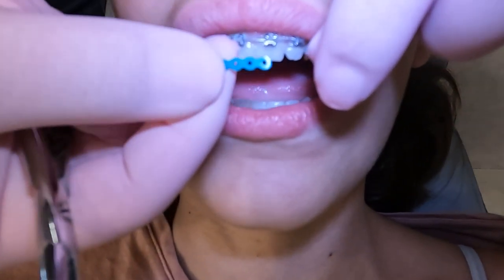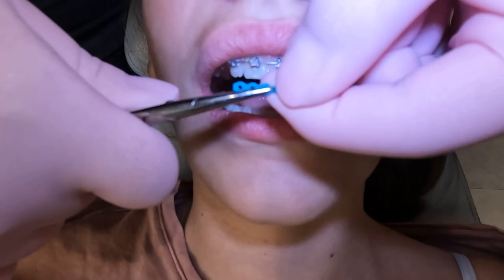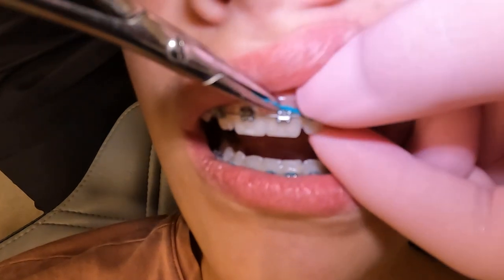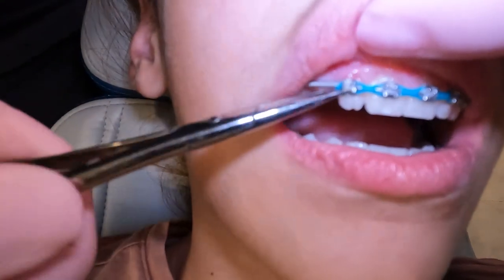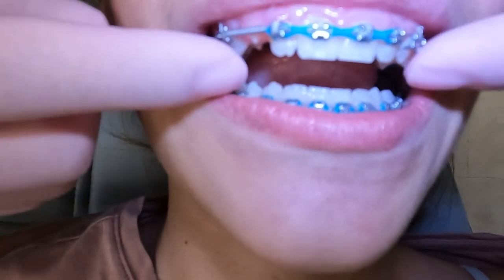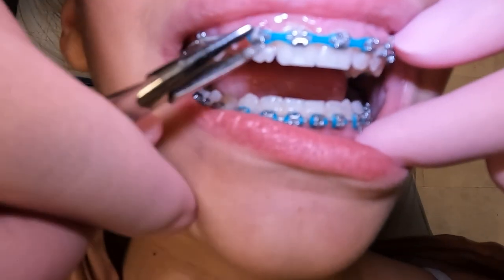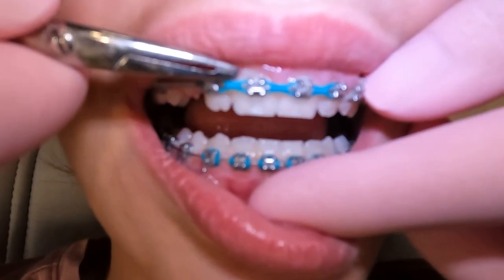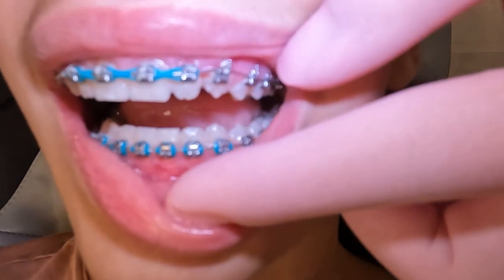The power chain is several links of those single ties all together — they don't come apart, so it's a chain. You can stretch it apart and use the same instrument. You get it on just like the single tie and then start pulling it across. You can see how when it connects compared to the singles on the bottom — see how it connects in between the brackets, right in there — versus on the bottom where there's nothing going in between the two brackets as far as colors. There's a space, which makes it even harder to clean under, so you've got to make sure you get all the food out from there. That is the power chain — it should feel nice and tight.